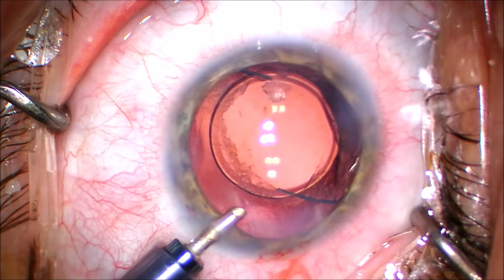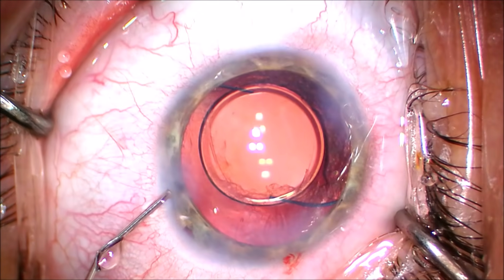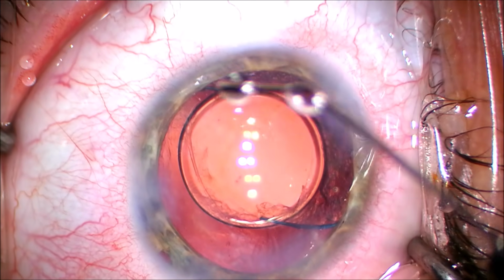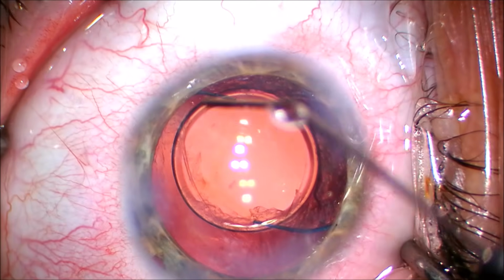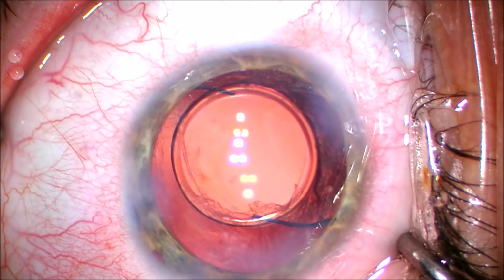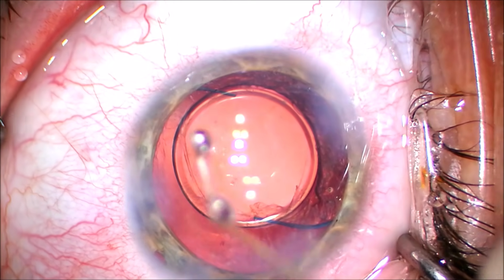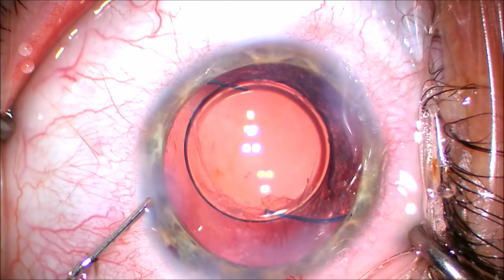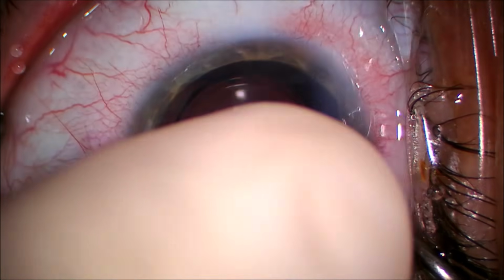Carefully take the AC maintainer out and then hydrate the incision. So again, you can see the optic capture configuration of the lens. Again, this patient had an intact posterior capsule. Presumably, the patient had a radial runout of the anterior capsule, so the surgeon just left the lens in the sulcus passively fixated with no optic capture.